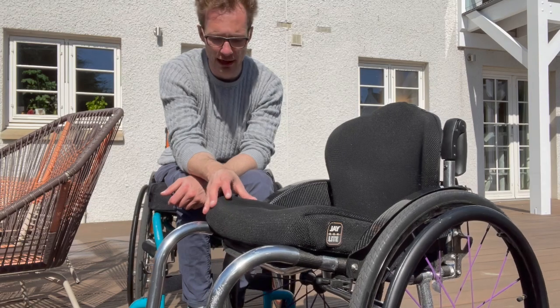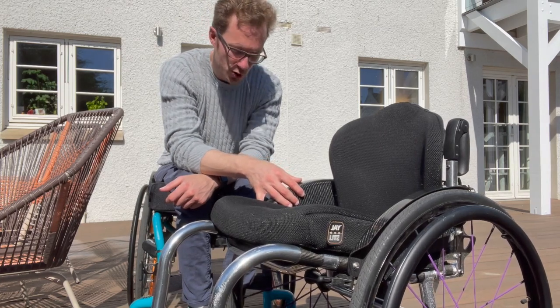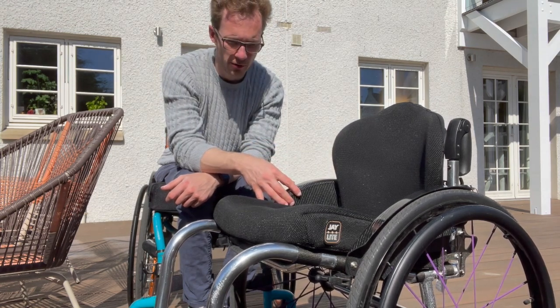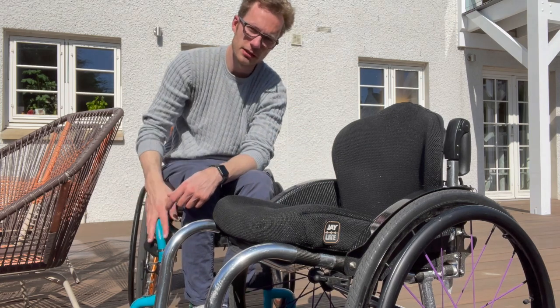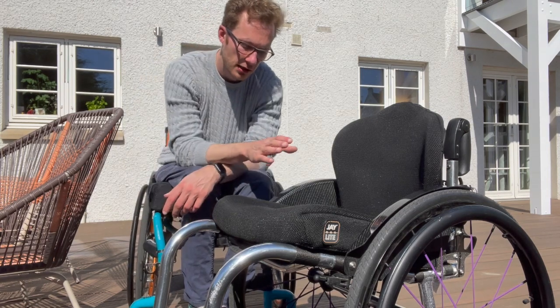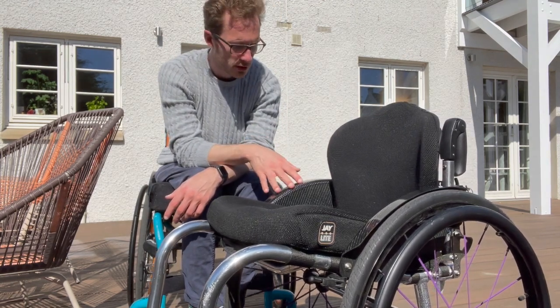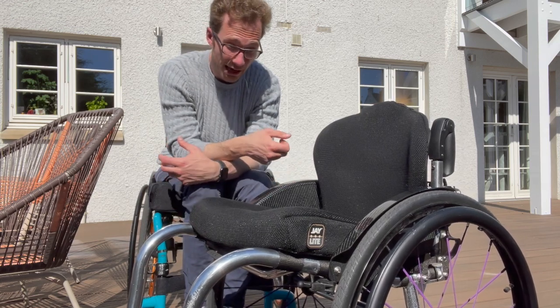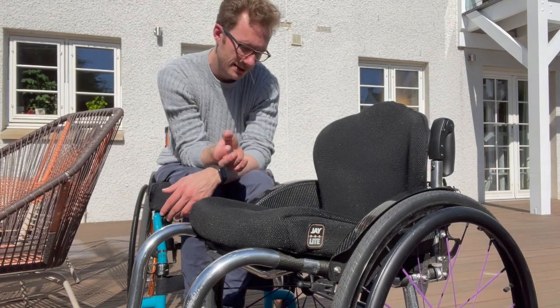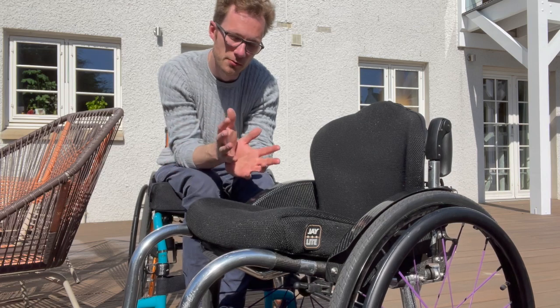In terms of pros and cons — the first thing to mention is that this is a made-to-measure chair, which is a huge pro. Having a chair measured to you is so much better for pushing efficiency, ergonomics, and comfort. It is day and night going from an NHS chair to this. These NHS chairs are also measured but there are far fewer measurements taken and it's far less customizable. I noticed a huge difference going from my Quickie to the RGK TIGA Sub 4 — the turning circle is tighter, it's more agile, I feel more comfortable, and I'm less sore at the end of the day.